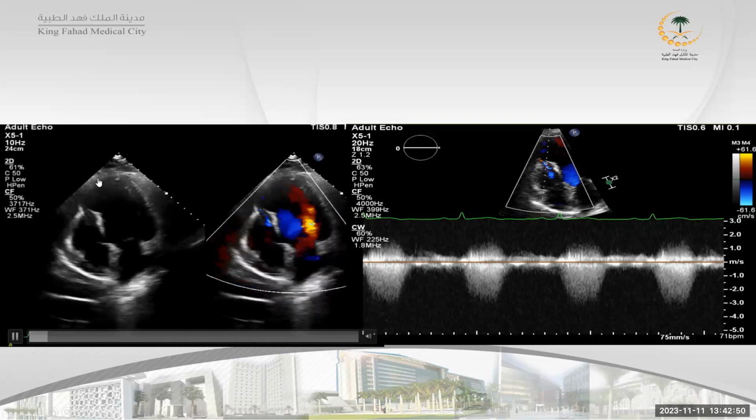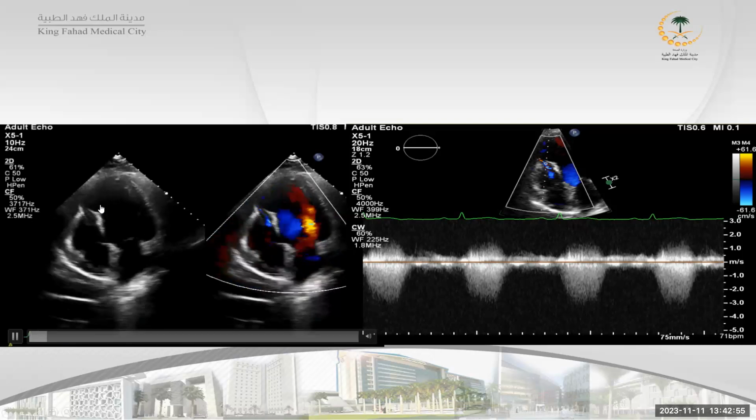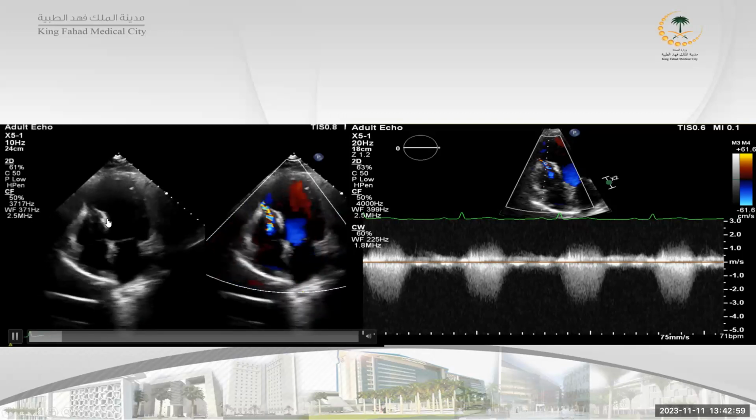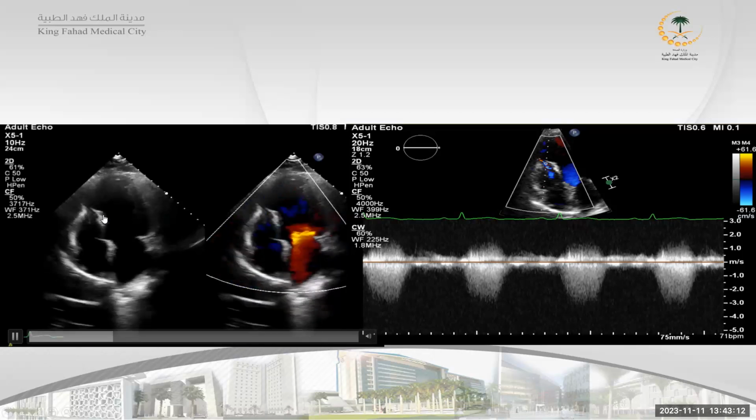septal site or septal segment of the apex. That's right. It is thinned out, we cannot even see any part of it here. And also because there is a hinge point. Hinge point is a very strong indication of an aneurysmal segment. You know the hinge point, that means this is the discrimination point between the healthy myocardium and the aneurysmal myocardium. This is very typical for true aneurysm.